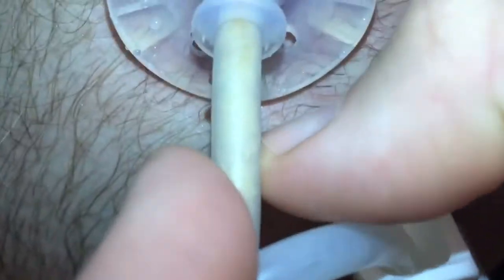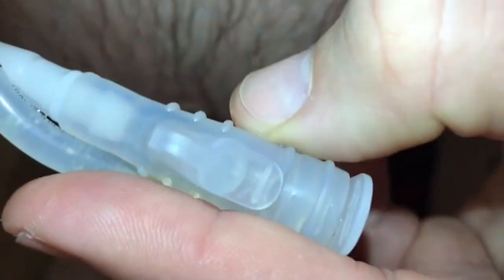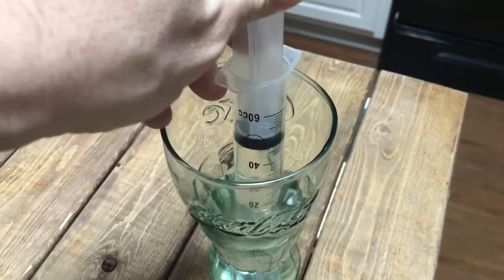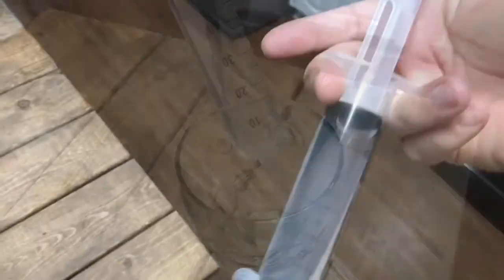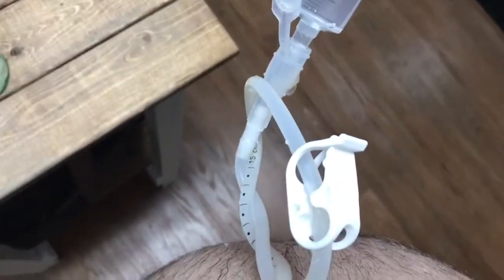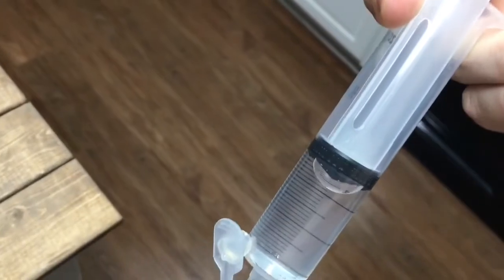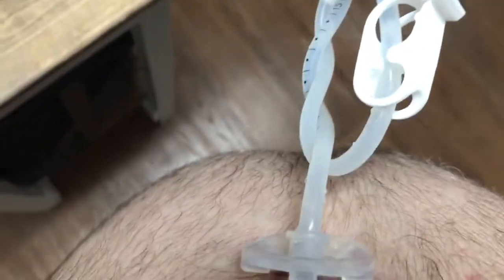And as you can see also on the tube, there is some formula that backs up into the tube, so we're going to flush that out. So we have lots of water and a syringe, so I'm just going to suck up 60 milliliters of water. And then flushing it through. And that is how I take care of my PEG tube every day, at least 3 times, if not 4.